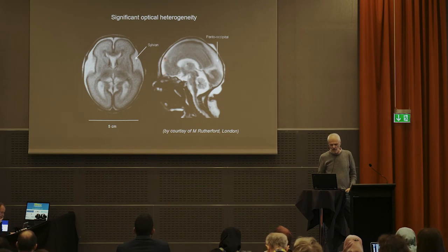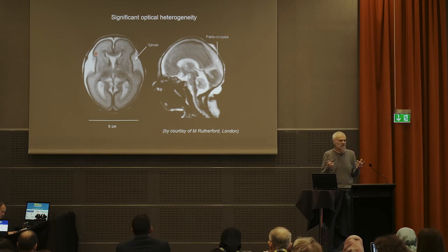But the fact that they react differently to hypoxia is another question. And I think it's most likely because the head is really not the brain only. There we have some pockets of CSF, and you put your sensor here, sometimes you have a lot of these clear layers, so that photons will travel not in a homogeneous way, but in an inhomogeneous way. So this is an issue which we might address by getting more spread sensors, or by other ways. So this is a problem. So it's never going to be an exact measurement, I don't think.